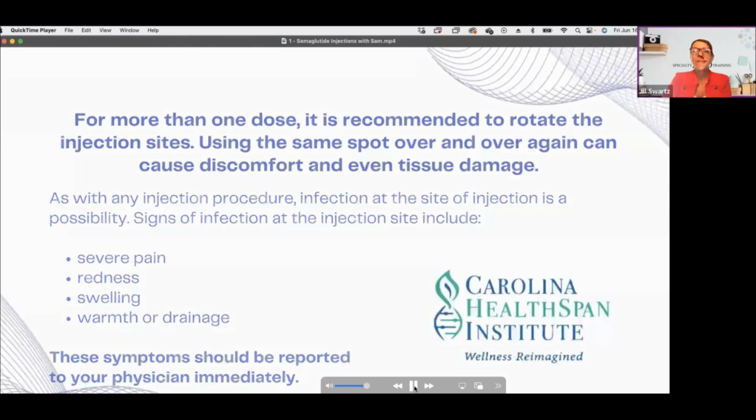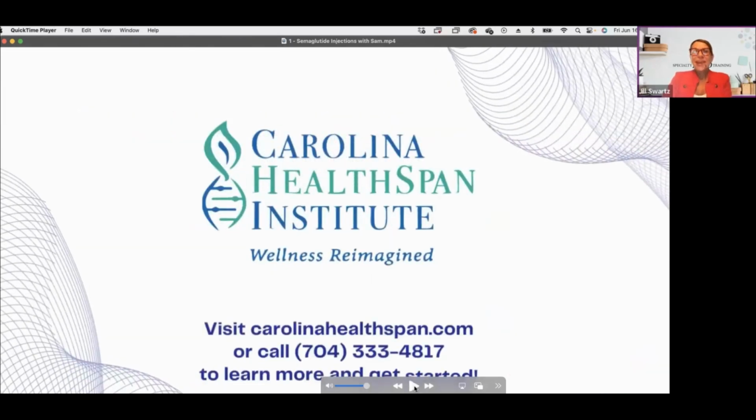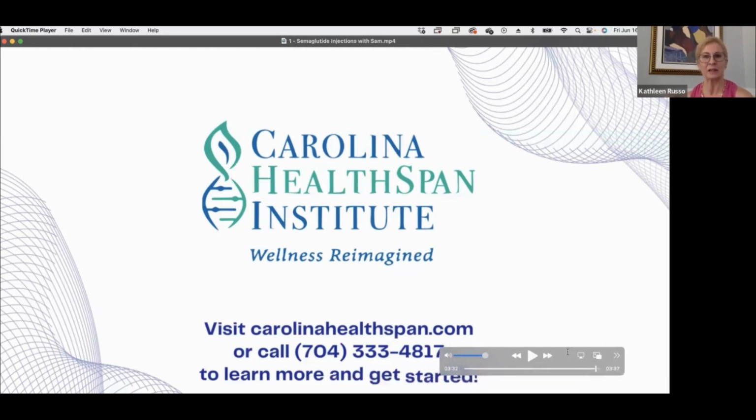Okay, great. Well, that was awesome. I think it's so important even just to see that. I didn't even know, and I've been in this space, that you pull back the syringe and fill it with the amount of air in the dosing site. It's just making it easier to pull. So that's a great little pearl. Sure, it just allows medicine to come out of the vial a little easier.